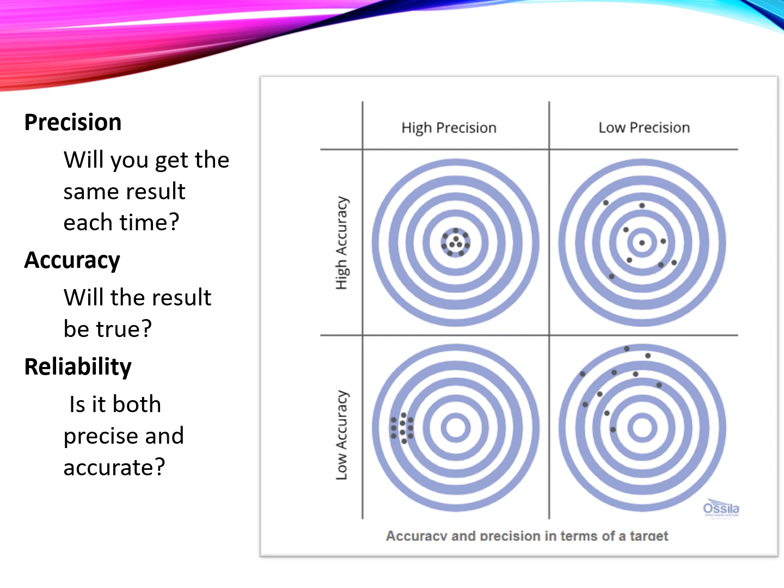And one of the things that we can do to ensure that our machines are giving out accurate and precise results is to always be on top of quality control. And then we can also send out our results to another lab to make sure that we're getting the same results as everybody else. And also make sure that we are considering the procedure of obtaining and running the sample correctly. Make sure that we have a clean stick and that we're using the right tubes and that the blood is separated properly, and keep all these things in mind when we are looking at the results.